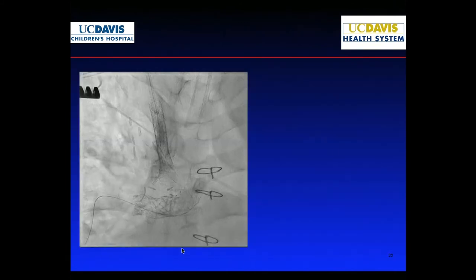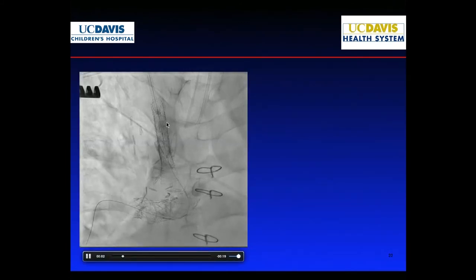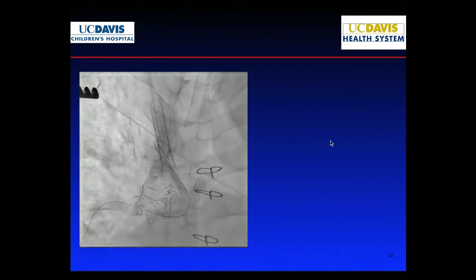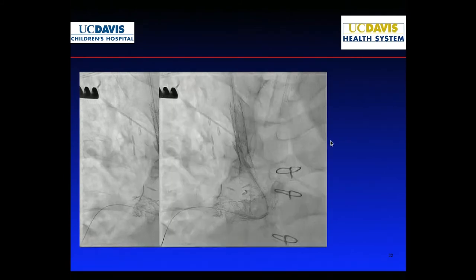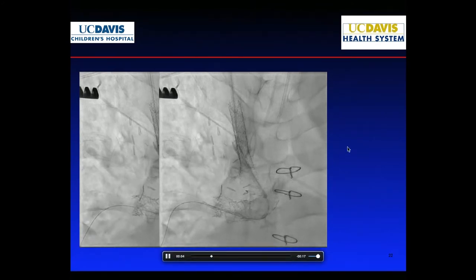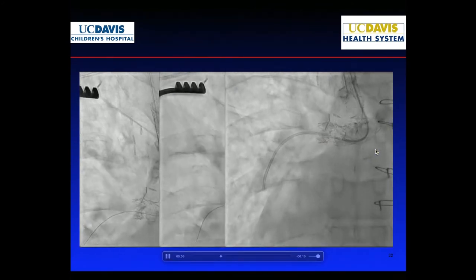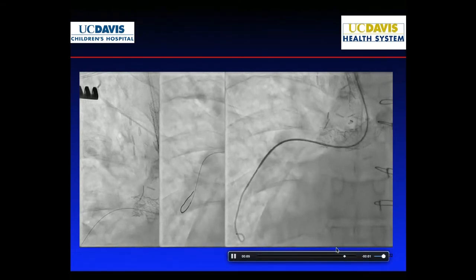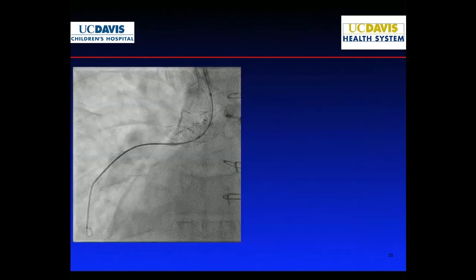And then with the balloon up, now there's a little technique: if you actually advance the balloon and inflate the balloon and use that balloon almost like your dilator, you can run everything through much more easily. So we're able now to advance the sheath deeper into the BT shunt, and now we went through the edge of that stent in the lower lobe, and now we're putting the stiffer system in just to give us more support to advance further.